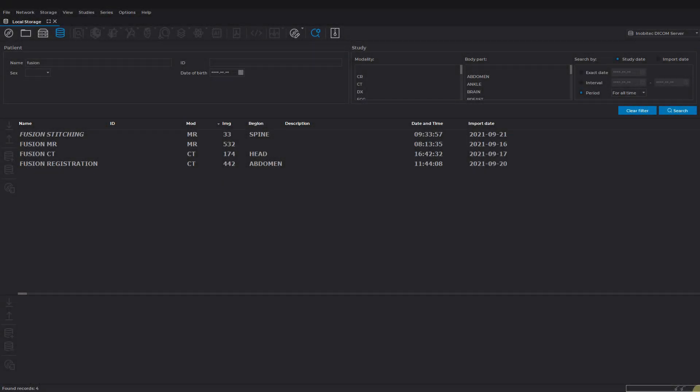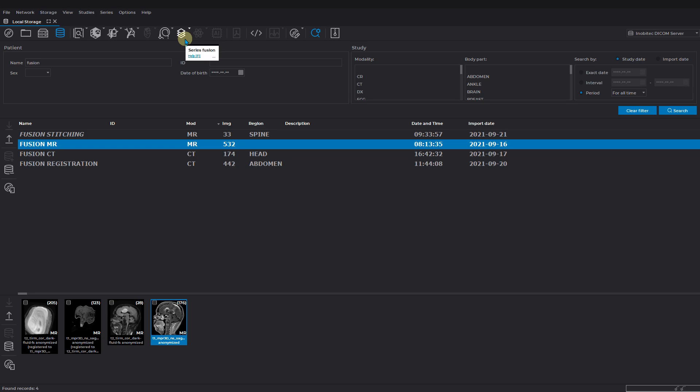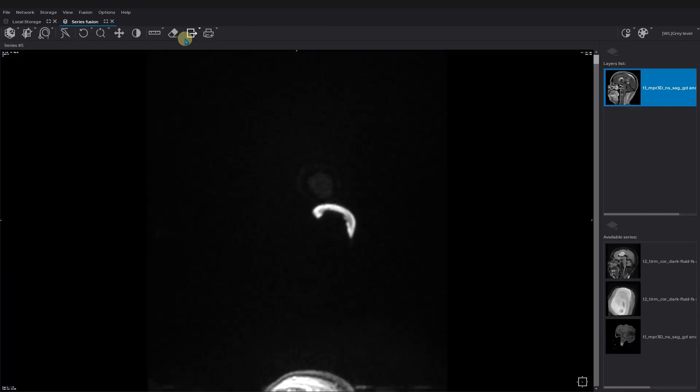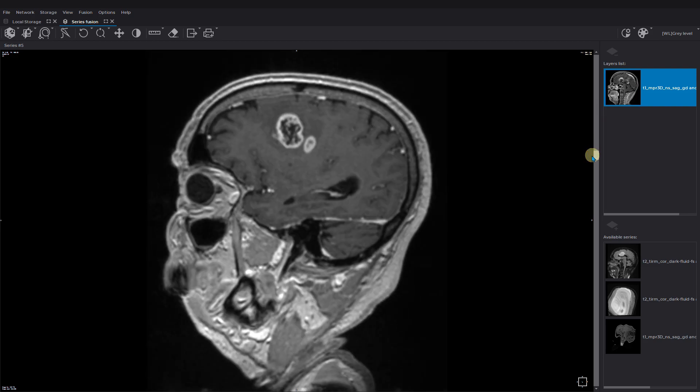Inobitech DICOM Viewer Series Fusion and Registration. The Series Fusion tool allows you to merge several series of the same or different studies. Choose the series and press the series fusion icon. Then choose the same study series in the right bottom field and click on the add icon above.